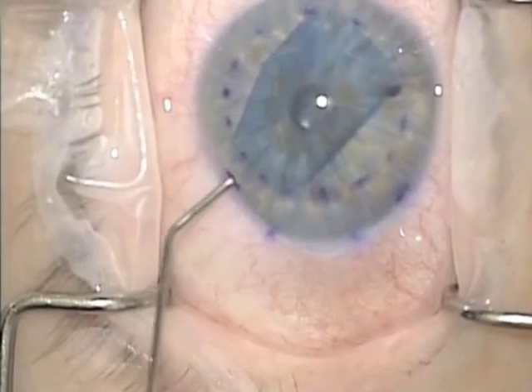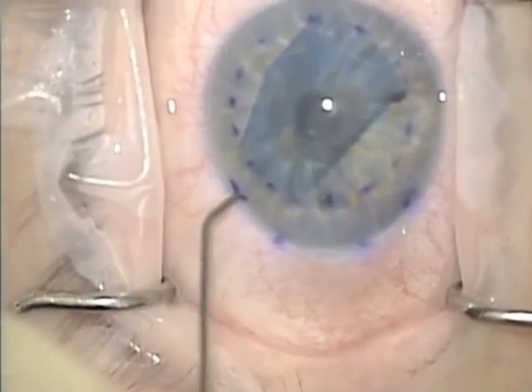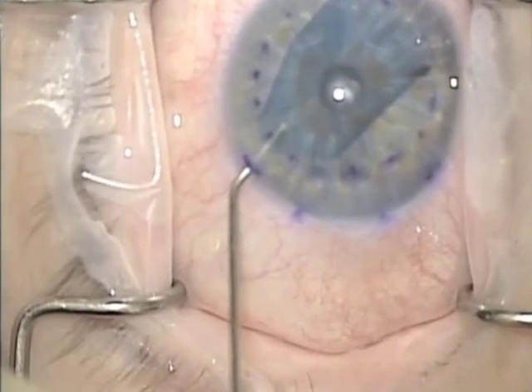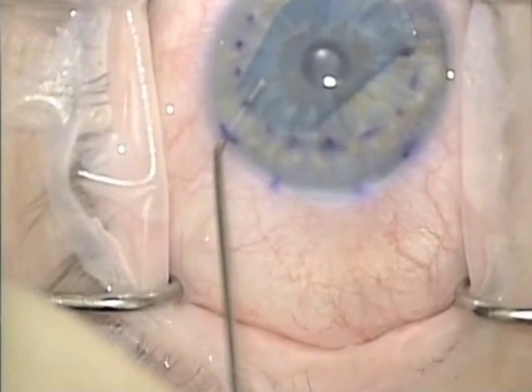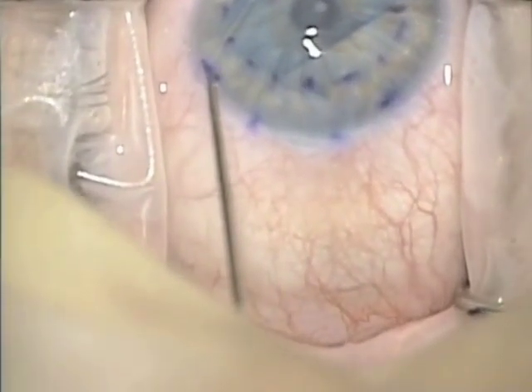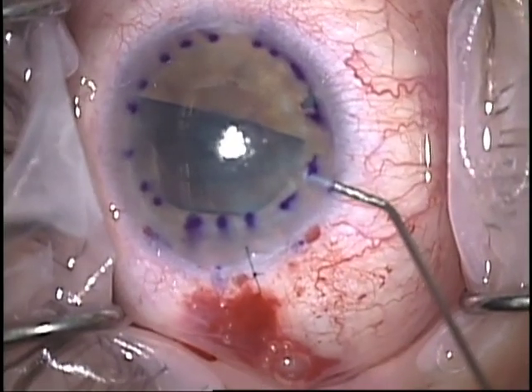Here's an example of me using this technique clinically. You can see there's a graft here with edge rolls, and I'm not 100% sure if it's right side up or not, so I'm going to put the cannula in and tuck it up, hopefully into a roll. I can see that the cannula disappears under the roll just off screen, confirming proper graft orientation, as shown in this picture by my partner, Dr. Terry.